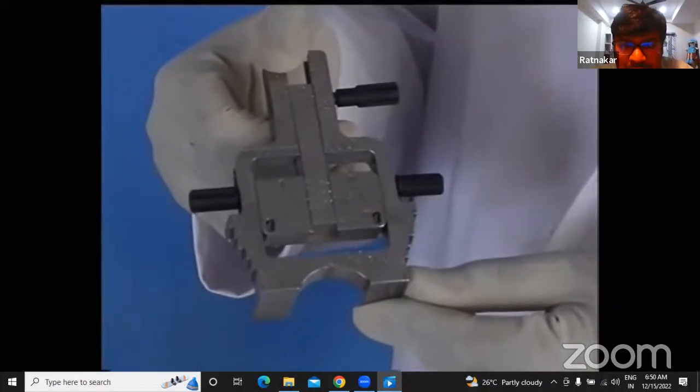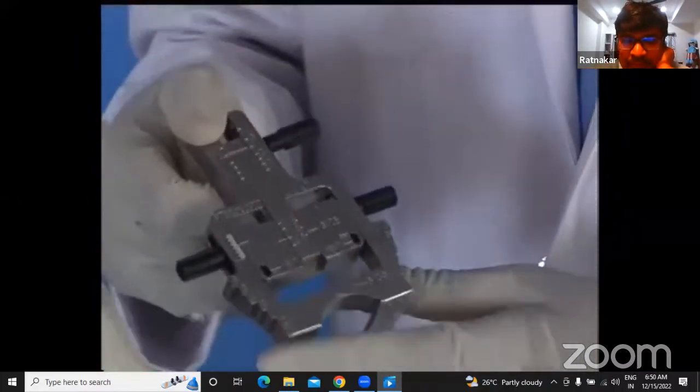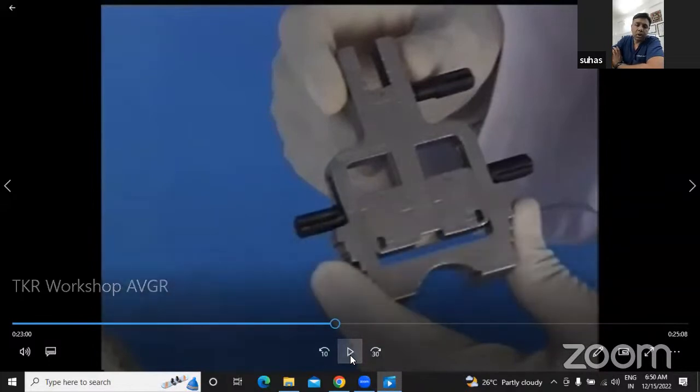Now this is a jig called the sizer plus external rotator cutter. Again, an important tip. Last time we discussed how to use the saw blade, right? That is the position of the saw. But what is very crucial and important is that before you hit the bone, the saw has to start. The blade is very thin, right? It is either 0.8 mm or 1.2 mm.